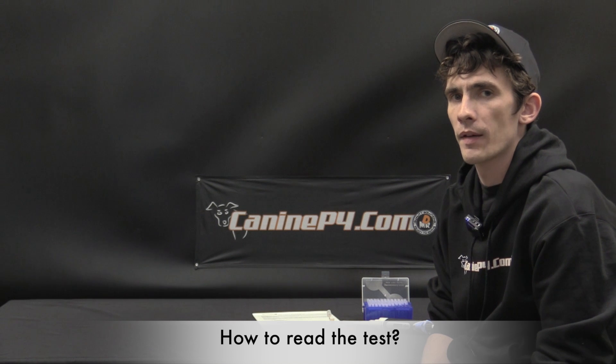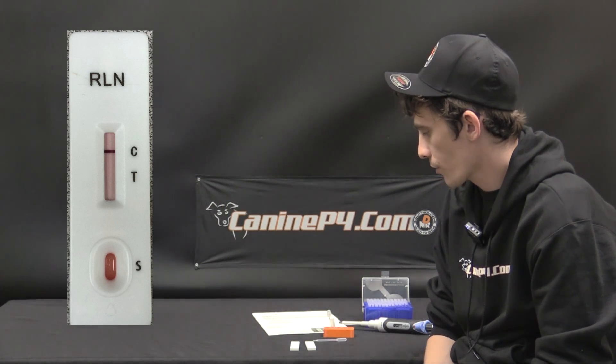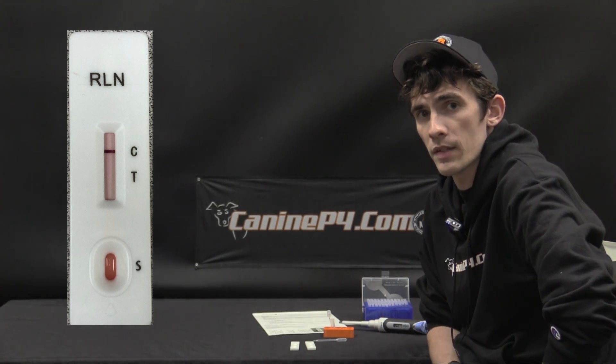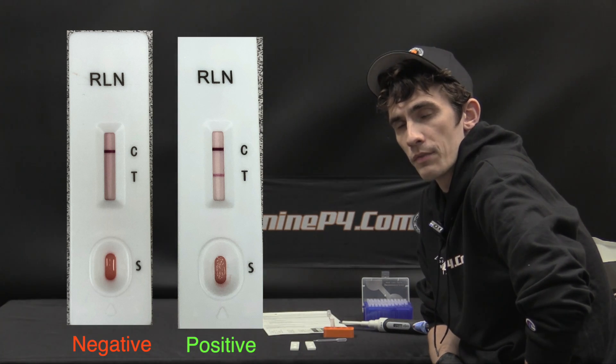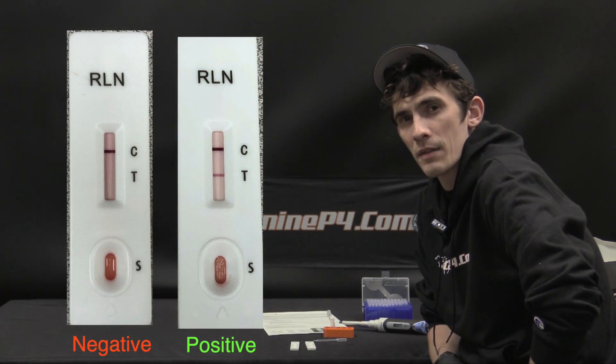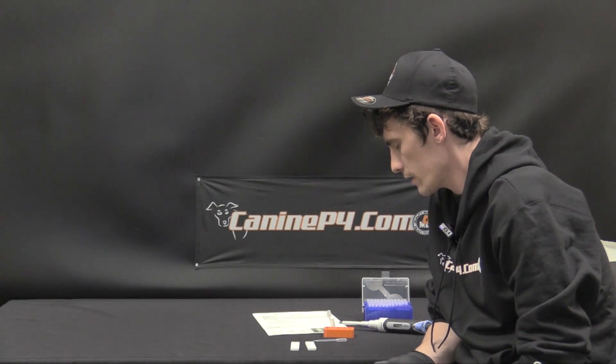The end results after 10 minutes are very easy to interpret. There are two identifiers: C and T. The control line, C, should always be present — if it is not there, reject that test and do another one. The T line tests for relaxin in the sample; if the T line is visible, either faint or as a full line, that indicates a positive result and means your animal is in fact pregnant. Any amount of relaxin in the blood is an indicator of a positive pregnancy, so all you need to see is both lines present.